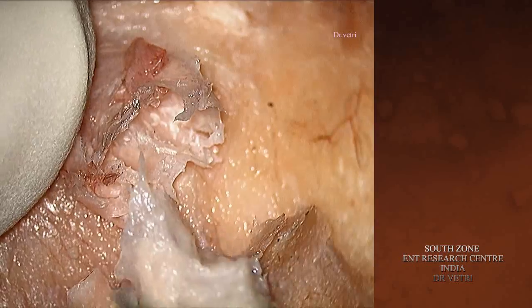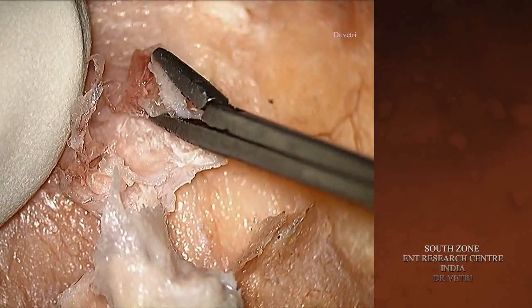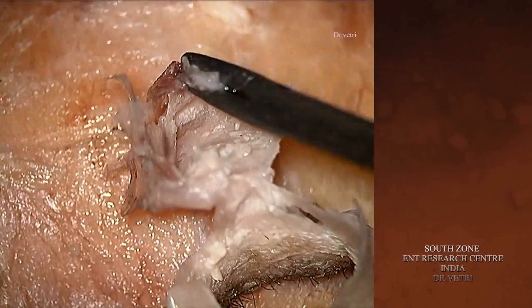So again, I would like to emphasize that this exercise will be very useful in creating the flaps in various forms of tympanoplasty.